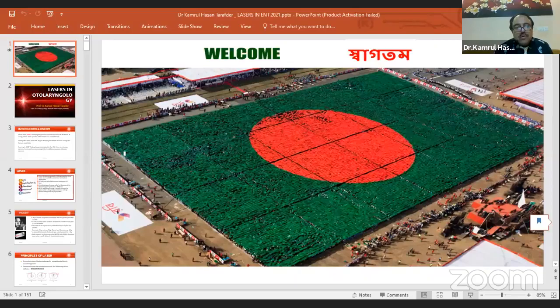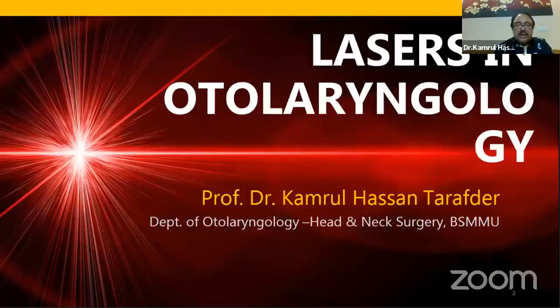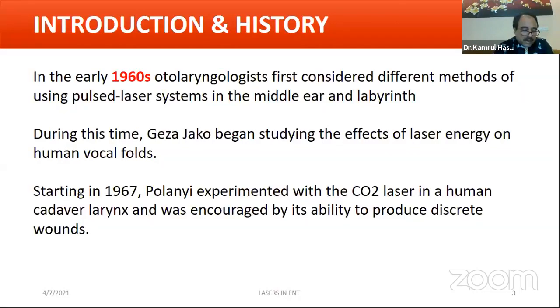So now, what is laser? Laser is an electro-optical device that emits organized light in a narrow intense beam. Light amplification by the stimulated emission of radiation, or laser as it is commonly known today, is an acronym whose theoretical basis was theorized by Einstein in 1917. And in 1960, Maiman produced the first laser.